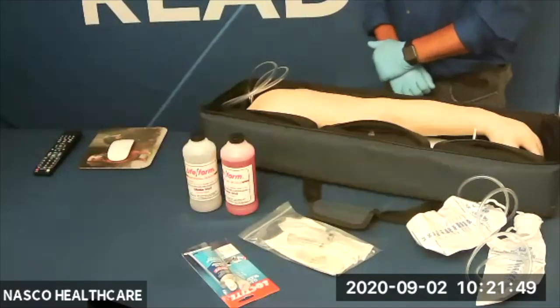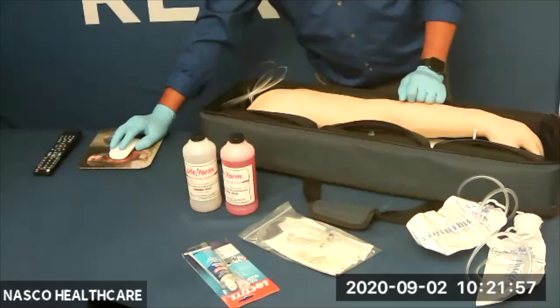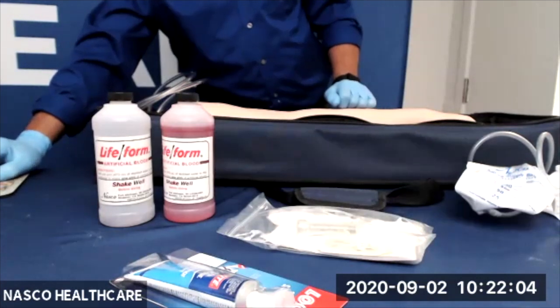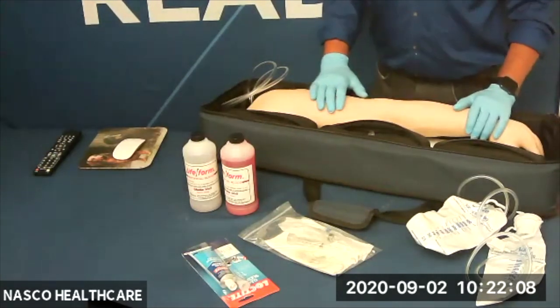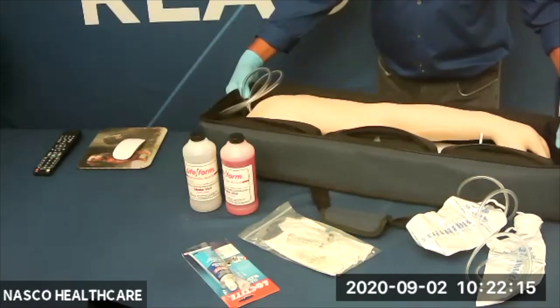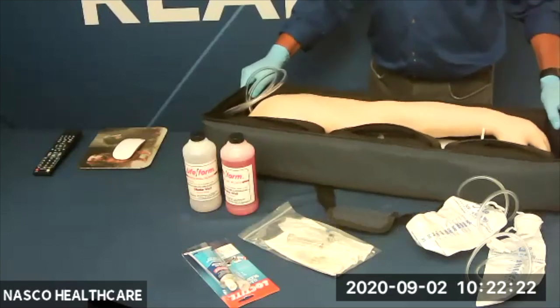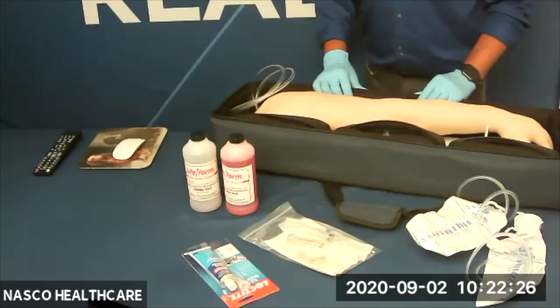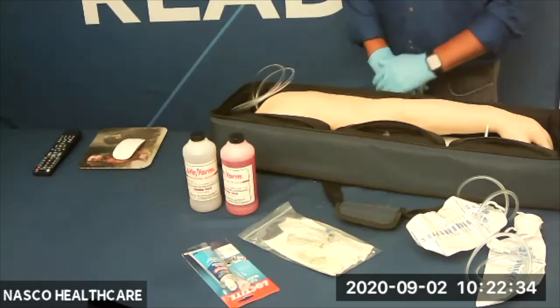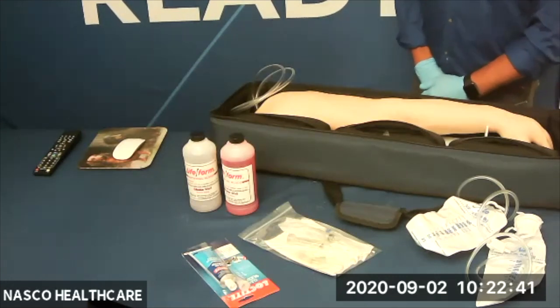The next feature today is our new multi-venous IV and injection arm. It is an evolution of our popular advanced IV and injection arm, and actually our number one selling product. This arm represents a full-size adult male arm and replicates the human condition as realistically as current technology allows. This IV arm is ideal for absolutely anyone who needs injection training — perfect for nurses, emergency first responders, lab technicians, phlebotomists, and anyone in the healthcare setting.